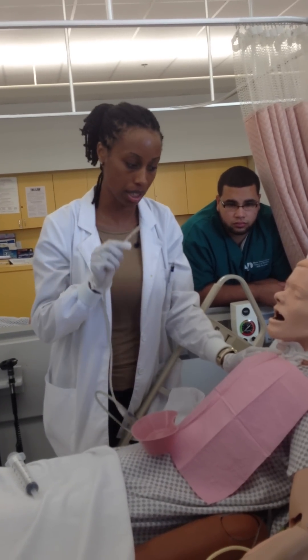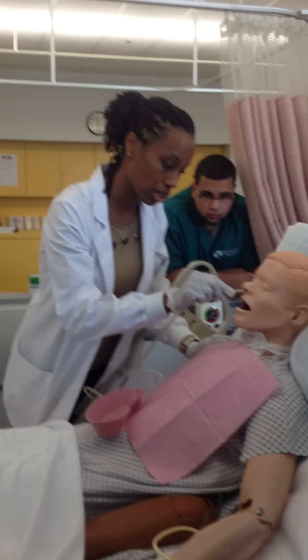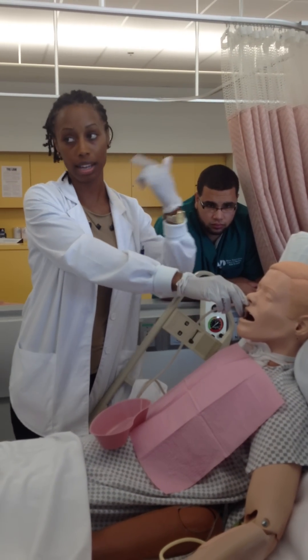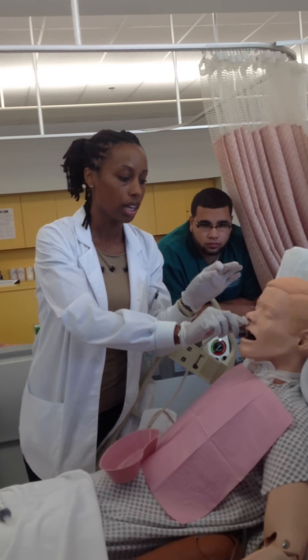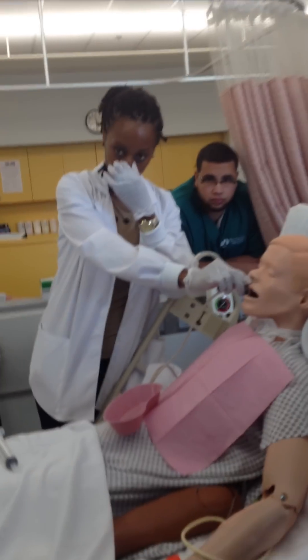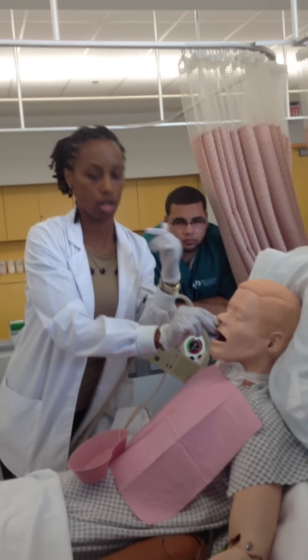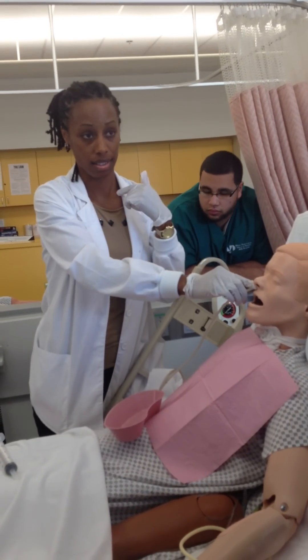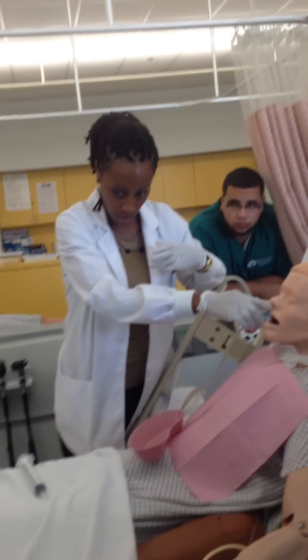Always have a hand on the patient as you go in. If you've assessed the right side is best, go ahead and have them lay back and take a couple of deep breaths. You will hear them choking and gagging, because when you get to that gag reflex, that is what initiates that. Once you get past the gag reflex, it's a lot smoother on the patient. As you go to the back of the nose, you will feel like a pop from the little bones back there — you're going to feel when you pass that, and then it's a lot smoother. When you make it past that point, tell them: now I want you to move your head forward and start taking sips of water.